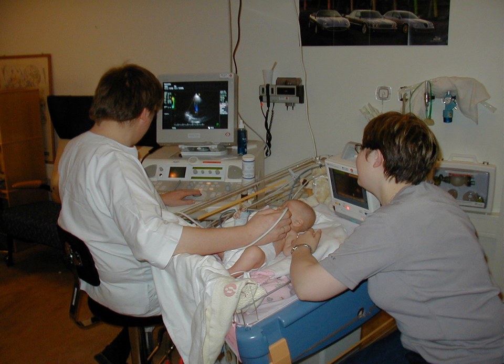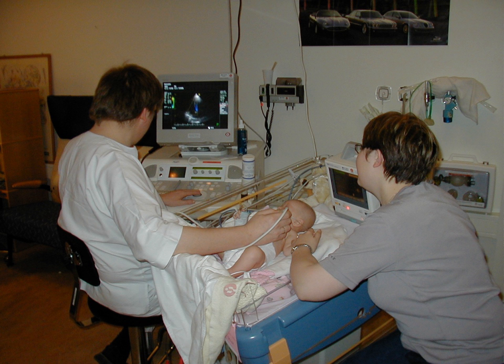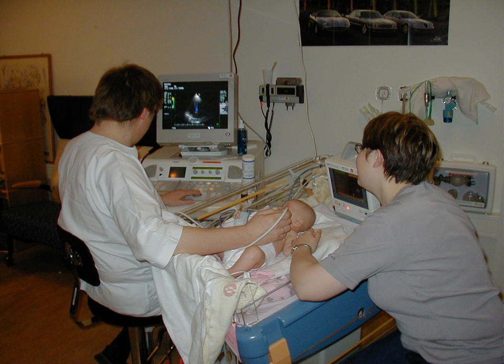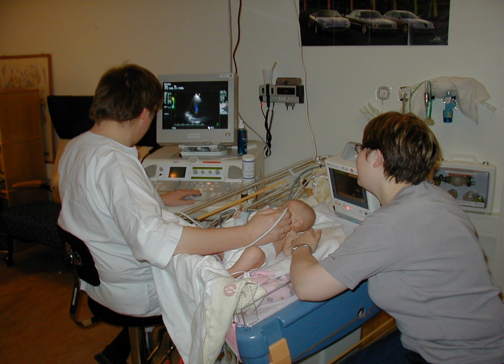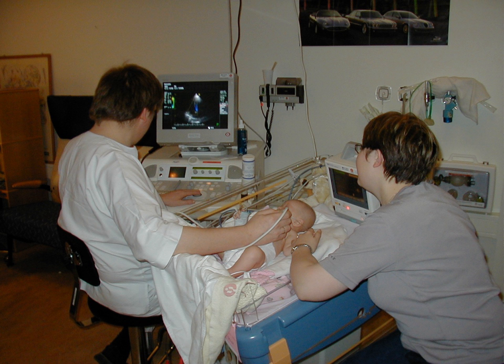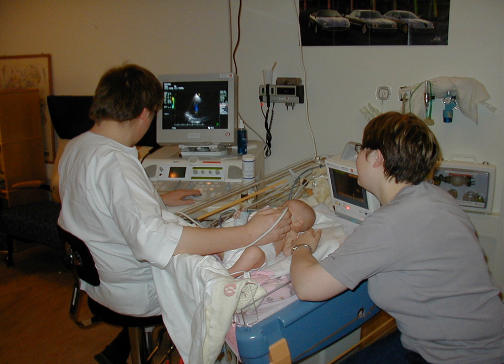In nephrology, ultrasonography of the kidneys is essential in the diagnosis and management of kidney-related diseases. The kidneys are easily examined, and most pathological changes are distinguishable with ultrasound, which is accessible, versatile, inexpensive, and fast for decision-making in patients with renal symptoms and for guidance in renal intervention. Using B-mode imaging, assessment of renal anatomy is easily performed. Novel applications have been introduced with contrast-enhanced ultrasound (CEUS), elastography, and fusion imaging. However, renal ultrasound has certain limitations, and other modalities such as CT and MRI should always be considered as supplementary imaging modalities.